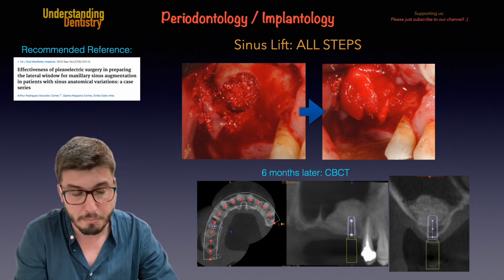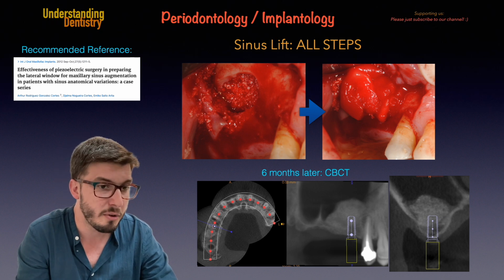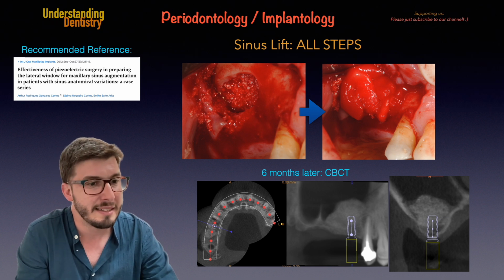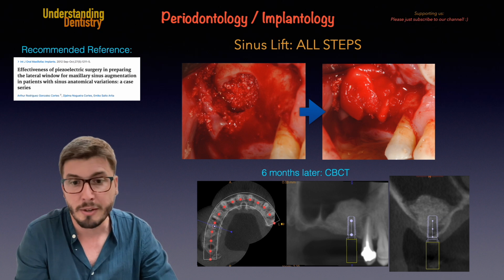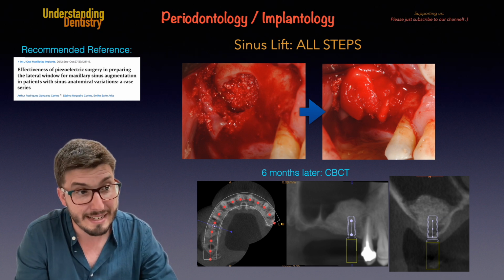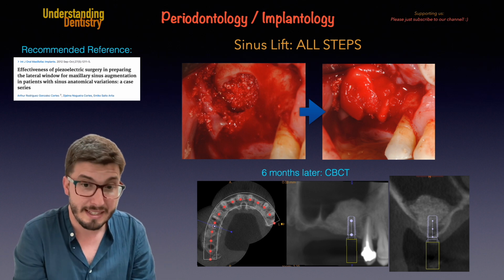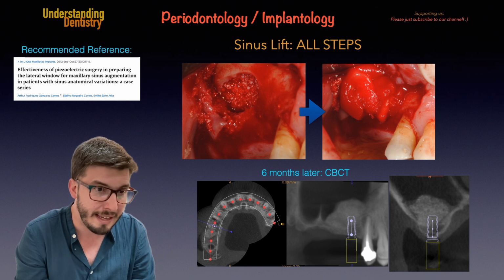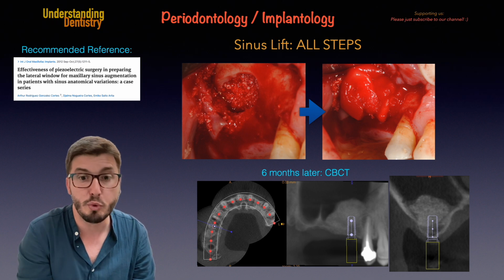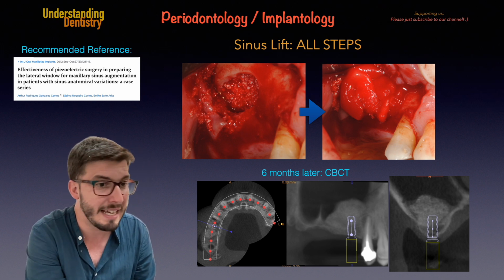And the most important plane that we need to use to plan our implant is, of course, well, all of them, but the most important would be considered the cross-sectional plane, okay? Or here would be the coronal plane as well, which is the one on the right side of the screen, okay, so the last one. And then we are seeing that part of the implant is still on native bone, and the apical part of the implant would be entirely on bone grafts, okay, and that's perfectly acceptable.